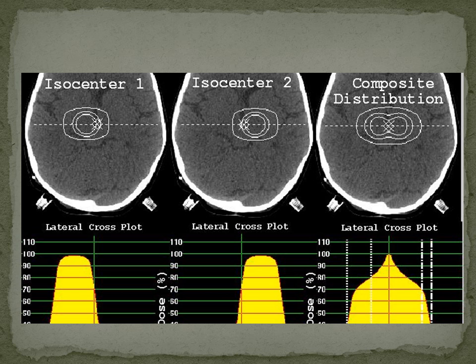We don't want to put a bunch of beams in and say, oh, I'm giving it the 80% isodose line, then find out that there's 130% someplace. So we've set our computer systems so that 100% is always maximum. And when we say 80, we know that's 80 relative to 100, not 80 relative to 120. But in that scenario, we have to switch our normalization down to the 70% line because of that issue.